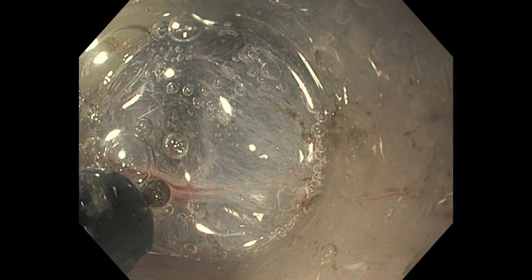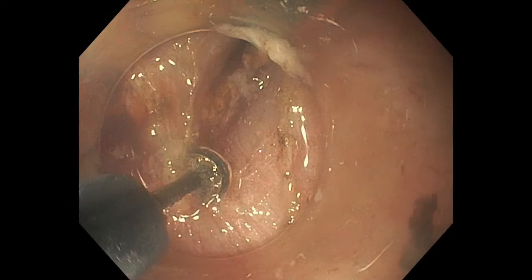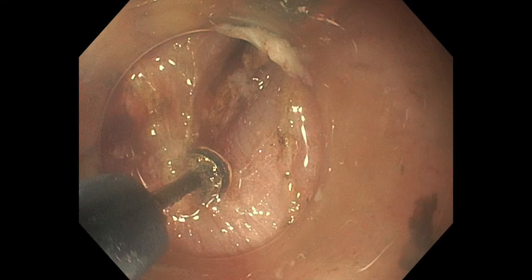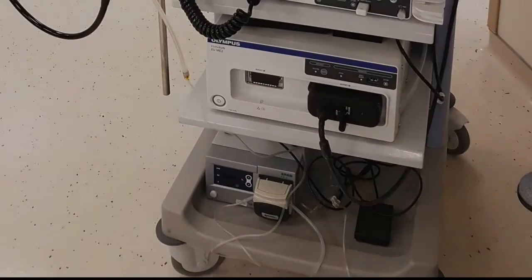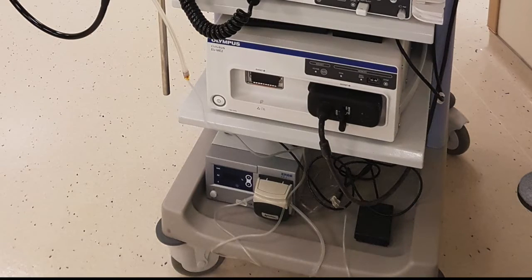ESD was initially performed with a tip cutting knife and then with a blunt tip cutting knife. A water pump was connected to the endoscope for flushing.